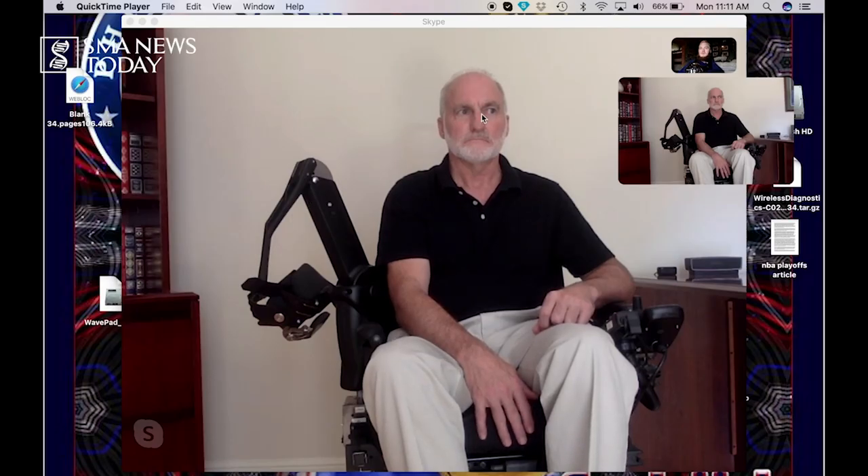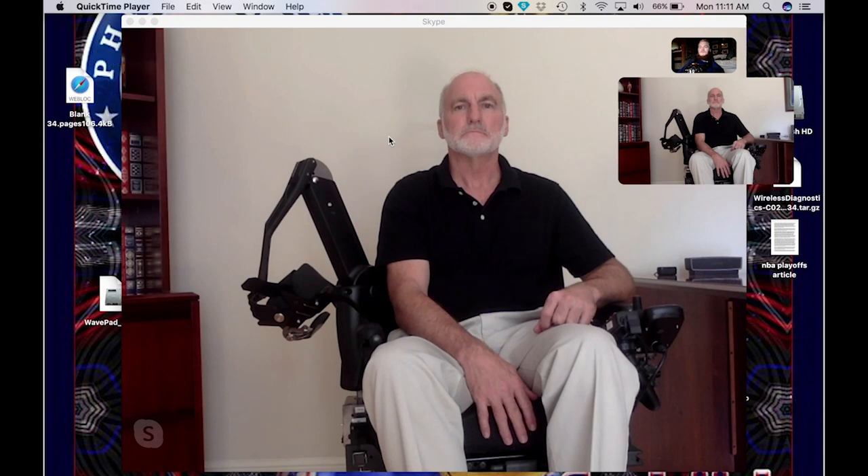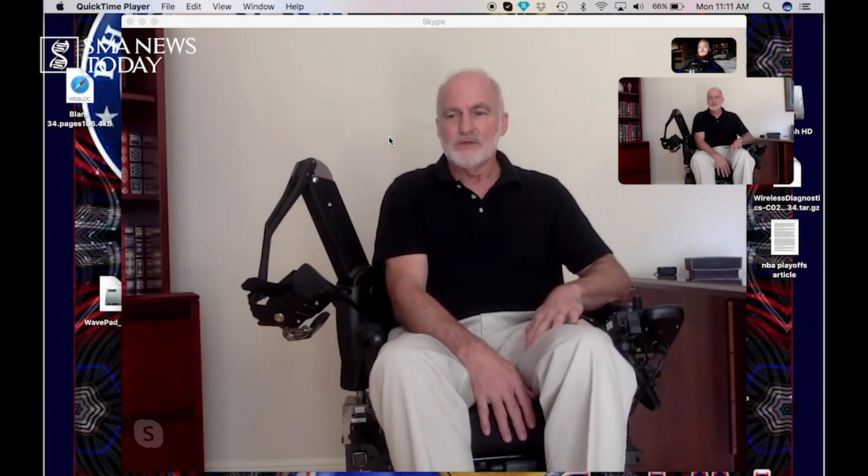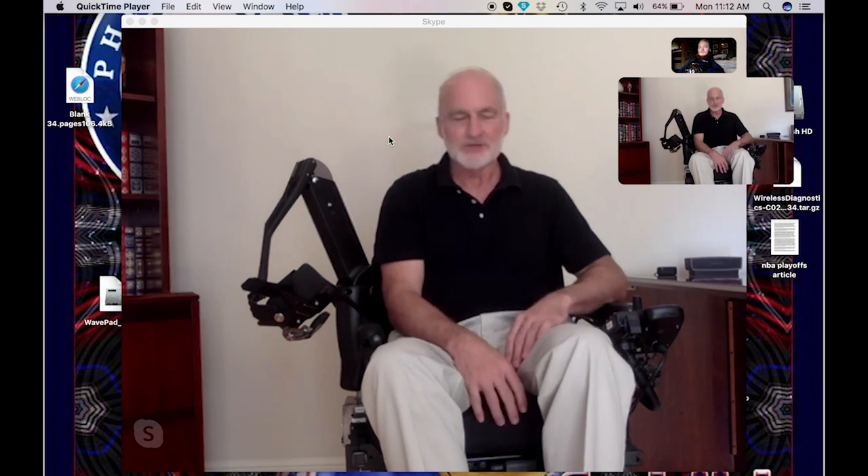We are here with Ron from Canova and he is going to demonstrate how the dynamic arm support works. This device is a powered arm support. It's new to the U.S. In the past we had mechanical arm supports available, but nothing that was powered that the user can control on their own. I'll give a quick demonstration of how the device works.